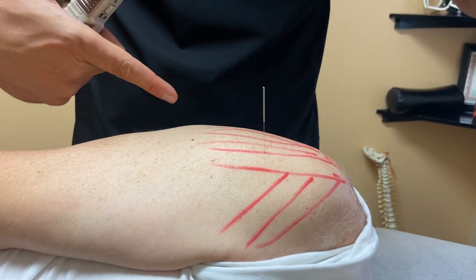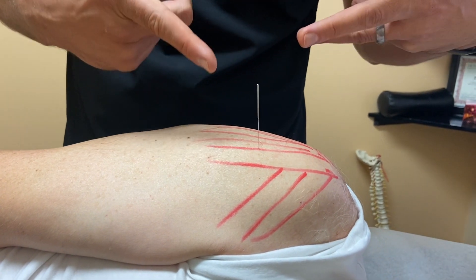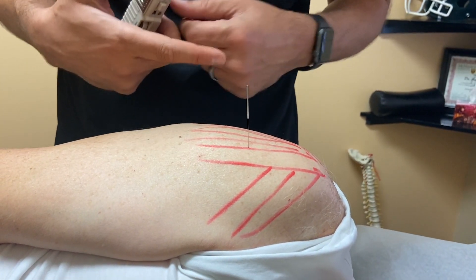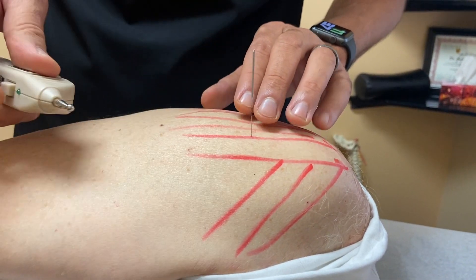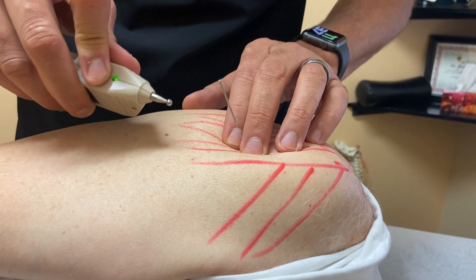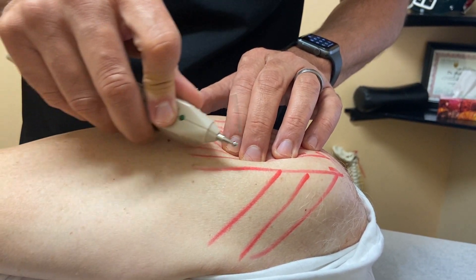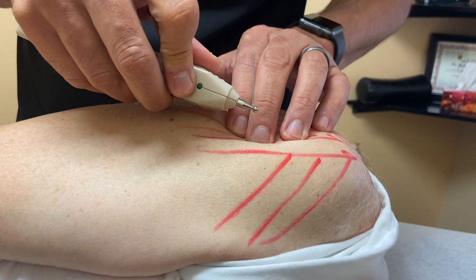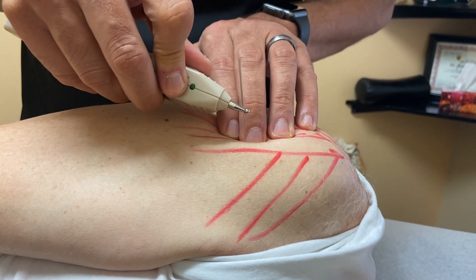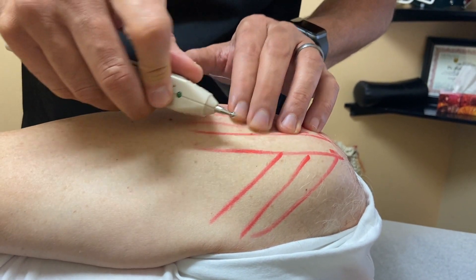In this case the deltoid muscle, and the neuromuscular junction is the junction between the deltoid and the axillary nerve. If I just place my hand versus compressing the tissue downward — see that response? When we stimulate it, I would stimulate for 8 to 10 seconds, and this will help activate the muscle that's inhibited.